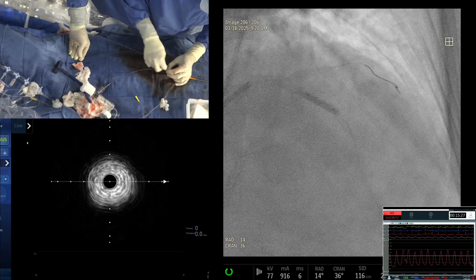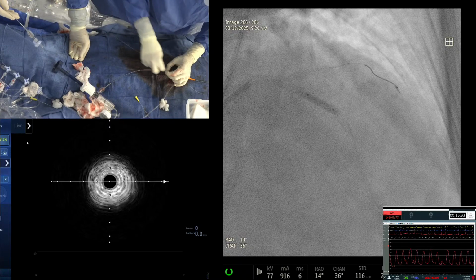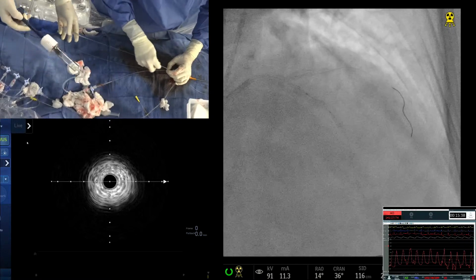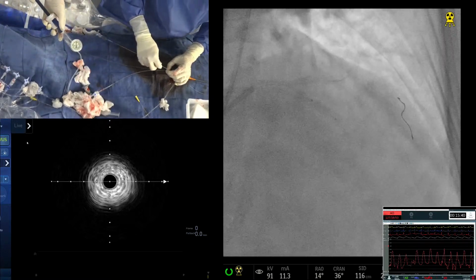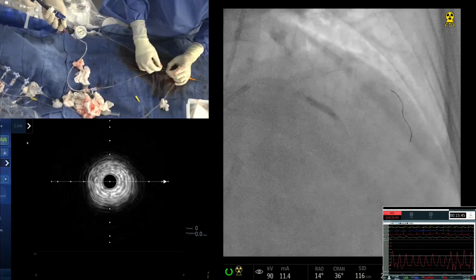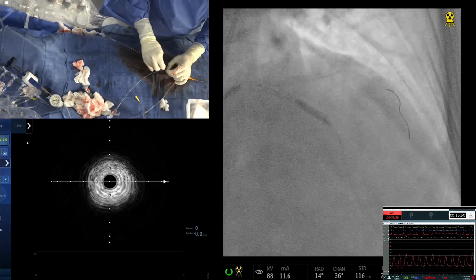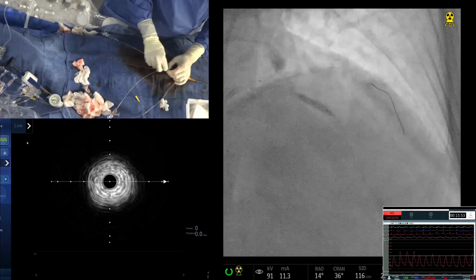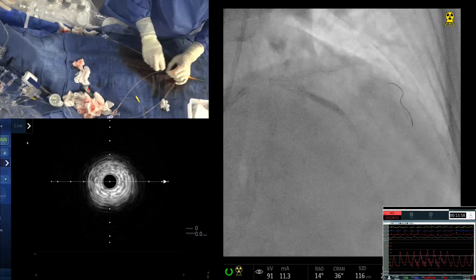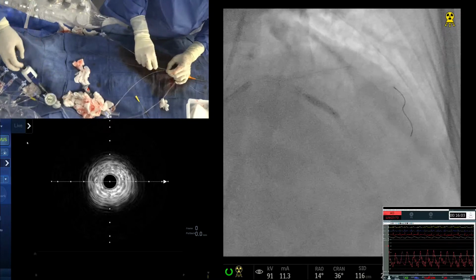Okay, we did anchor. We tried all kinds of balloons, 2.0 balloon. The way the wire was going, I knew a 3.0. Normally we say when you're doing left main mini crush, you don't need a Corsair, we have a smaller balloon, right? Do you have the Corsair or no? No, that's the next step. We have tried all the balloons, but our usual 1.2 balloon is... get us a 1.0 balloon now. Sapphire. Good. It won't go.